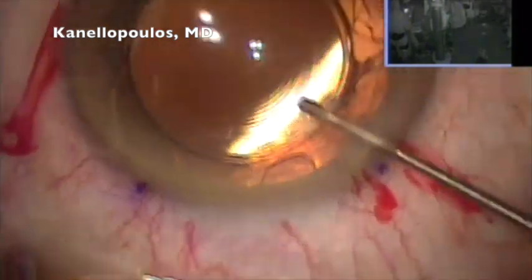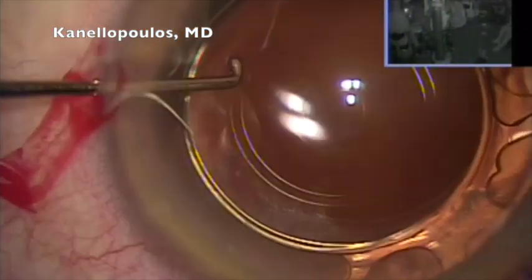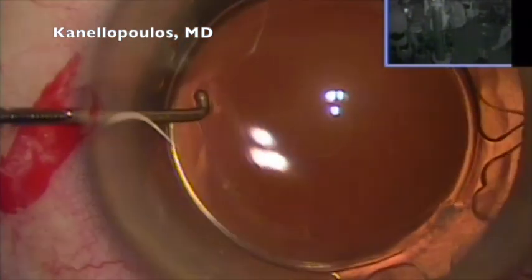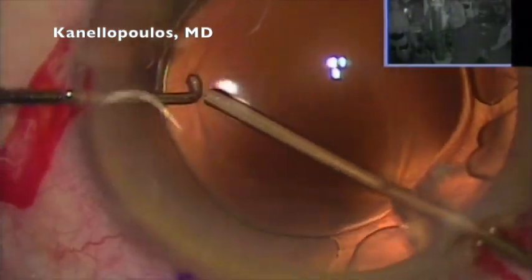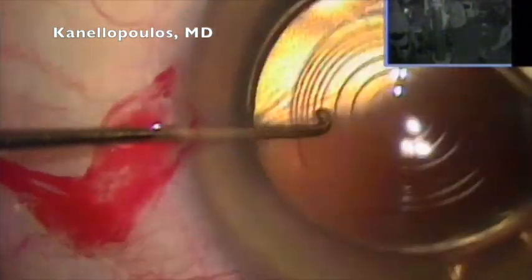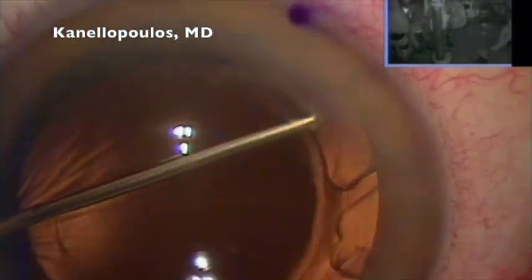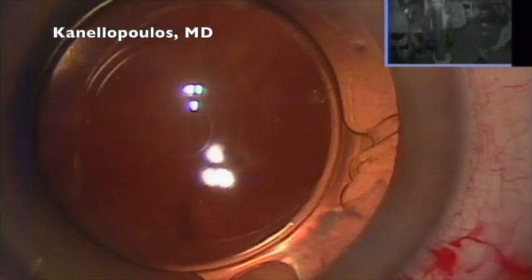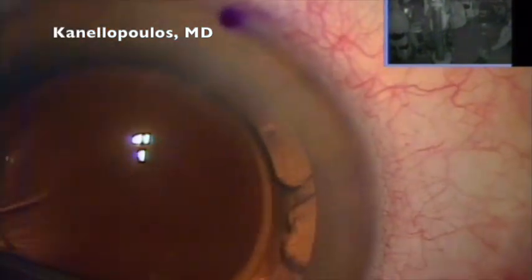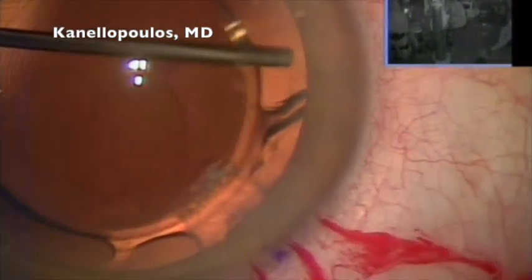I'm going in with Viscoat, and the trickiest thing here, two and a half months out after the procedure, is to find the edge of the anterior capsule. I remind you, this is a femto case, so I'm very concerned that the edge may tear. We know that the manual edges are more resilient to stretching. I'm going all the way around to get Viscoat around the lens, and the key thing is behind the lens.